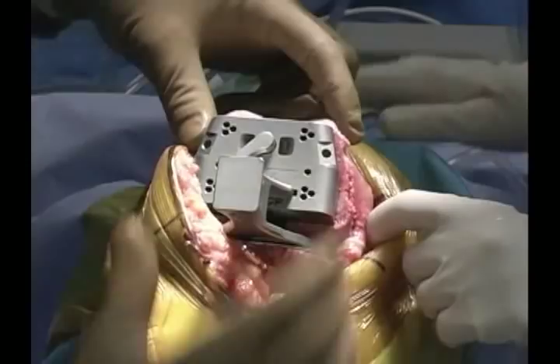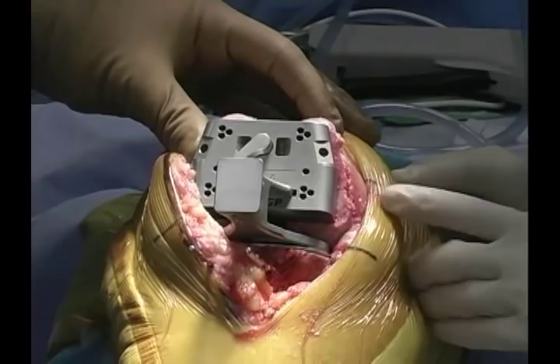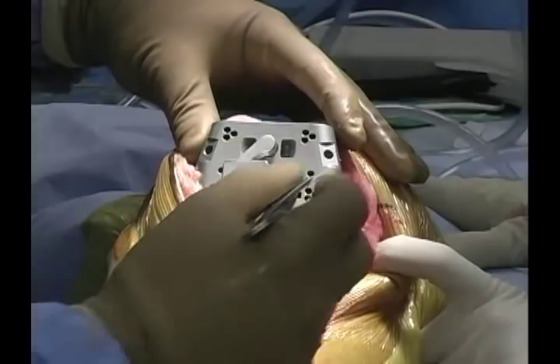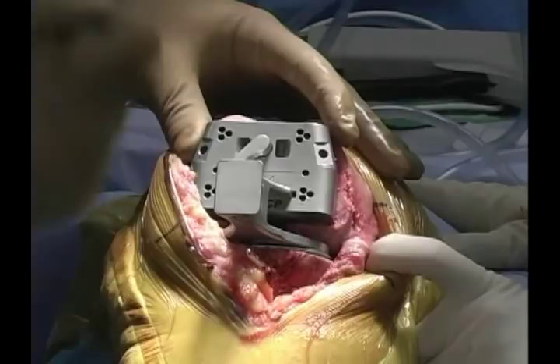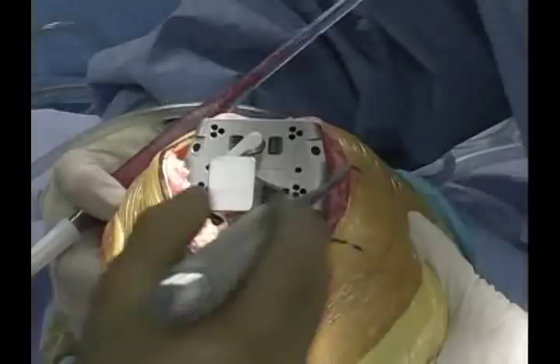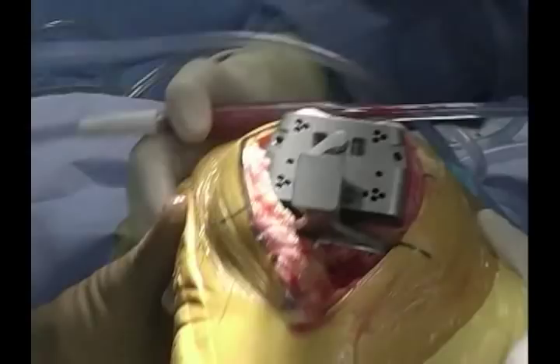The block is translated into place and we assess the stability of the flexion space. The femoral positioner applies tension to the collateral ligaments while the rod and block are free to rotate in the canal. The rotation of the femoral cuts will be parallel to the tibial resection, and the translation will be based upon the shim size — a 10 millimeter insert, as already established in extension. We can use a cob elevator to feel the tension of the collaterals on each side, and range the knee to assess — very similar to an LCS technique.